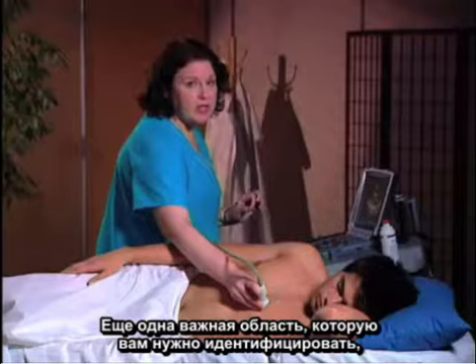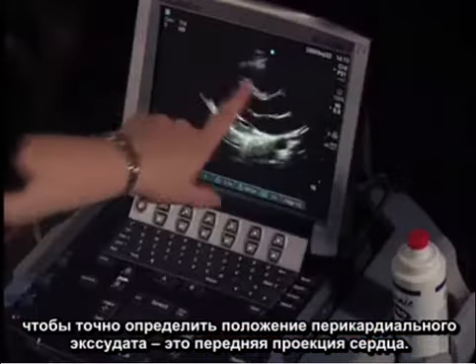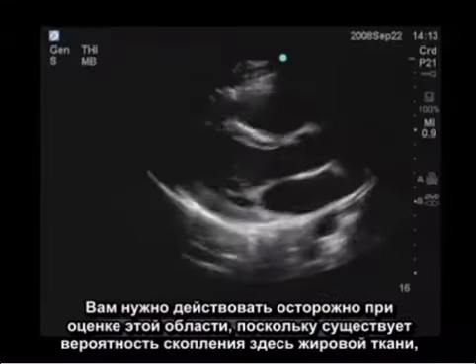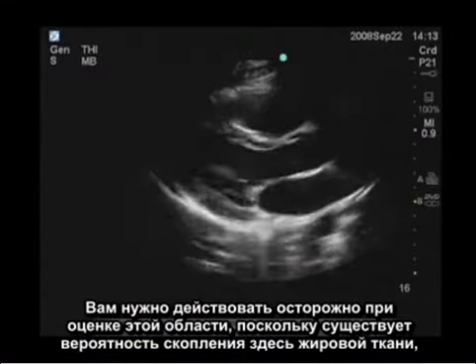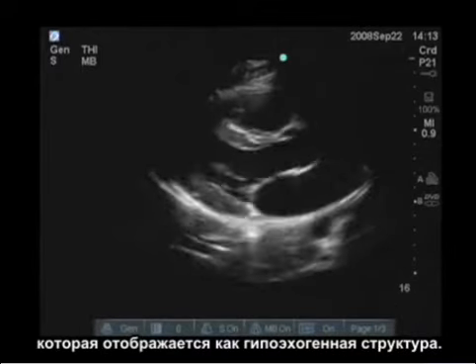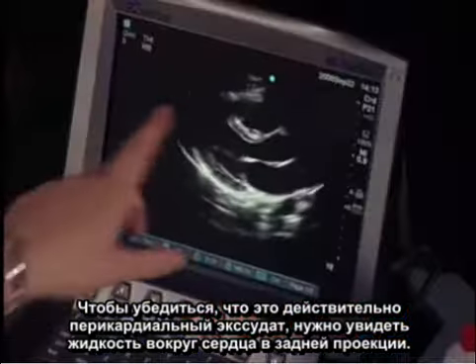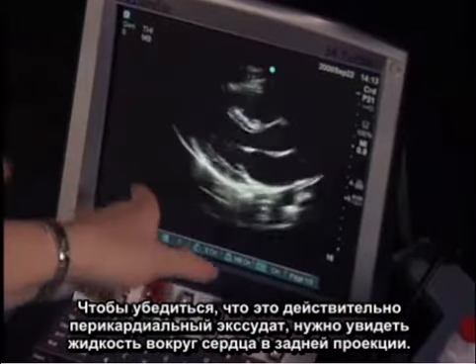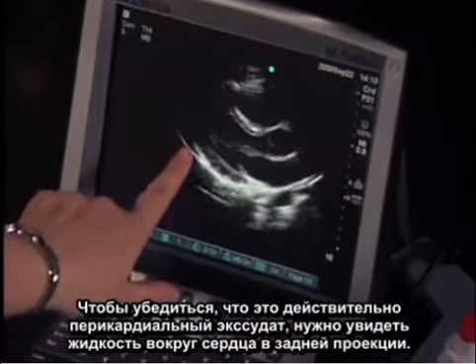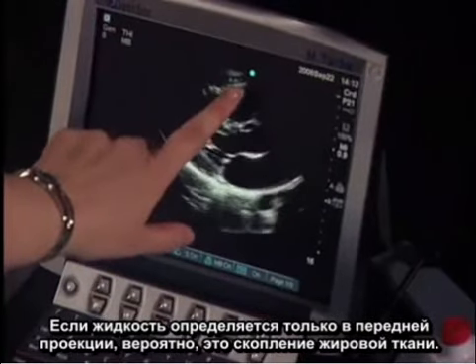Another important area you have to identify to determine exactly where the pericardial effusion is, is the anterior aspect of the heart. You have to be careful when you evaluate this area because there could be a fat pad in this area that appears hypoechoic. So for it to be a true pericardial effusion, we want to see the fluid wrapping all the way around the heart to the posterior aspect. If it's just here in the anterior aspect, it's probably just a fat pad.